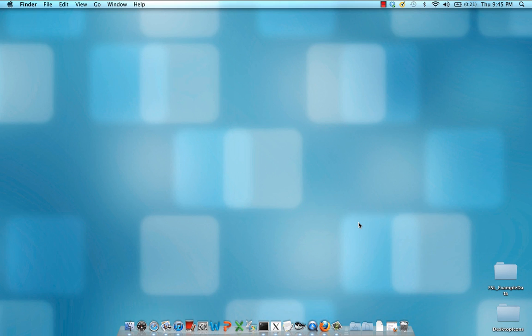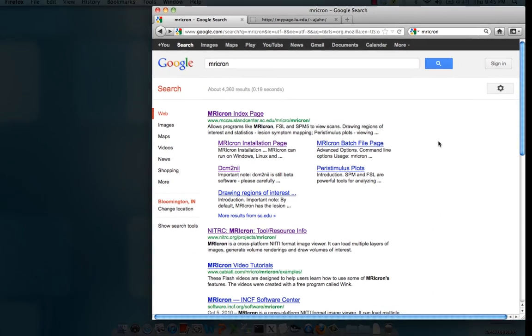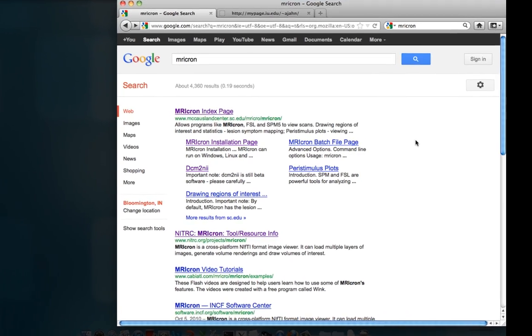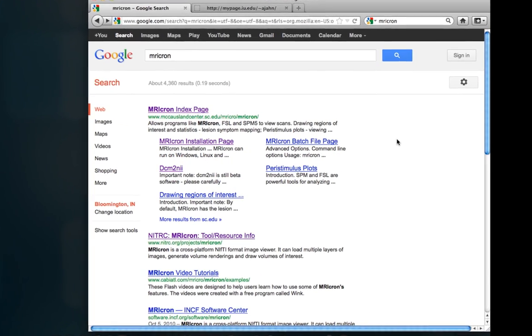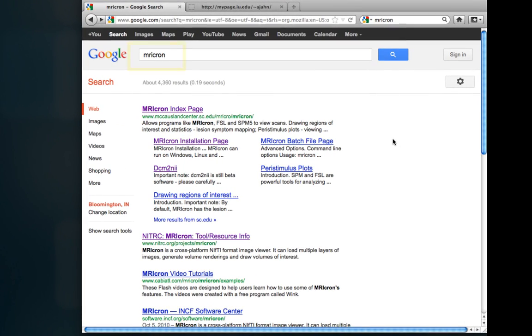The first thing to do is to find a suitable conversion program. The one recommended by FSL is a program called MRICron. Just type MRICron into Google and click on the first result that comes up.